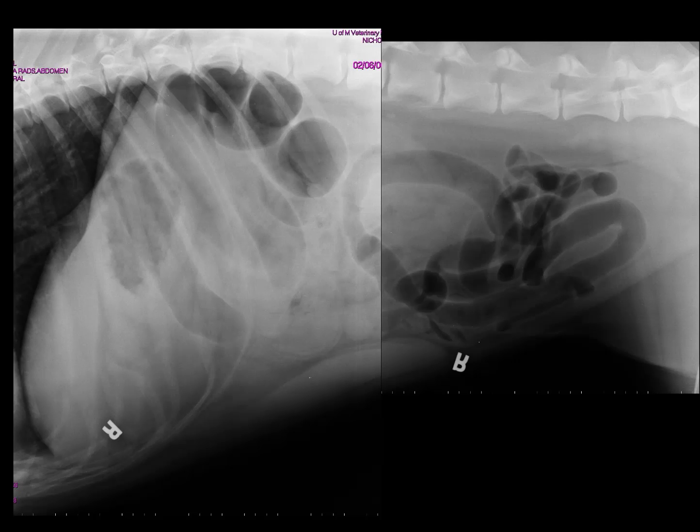And so this abnormal case is almost certain to have a colonic torsion because that's just what I talked about, and is a big dog, so I had to stitch together the two radiographs. And what we can kind of see is that we've got, at first glance, two populations of intestine, because we have a lot of gassy ones, but we have some that are kind of medium distension, not too distended, and then we have some more cranially that are a lot bigger. The problem is we don't know at this point who's small intestine and who's large intestine.